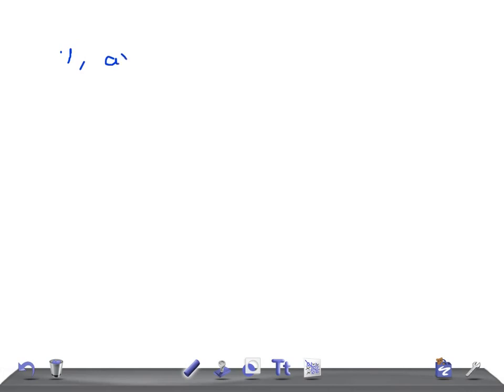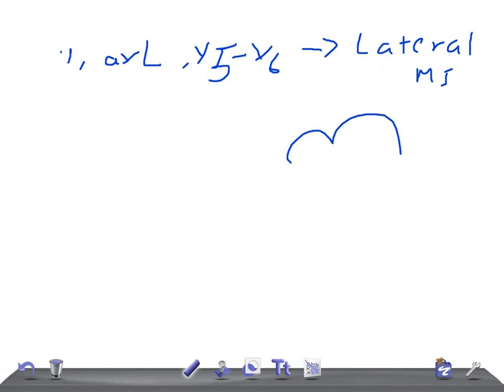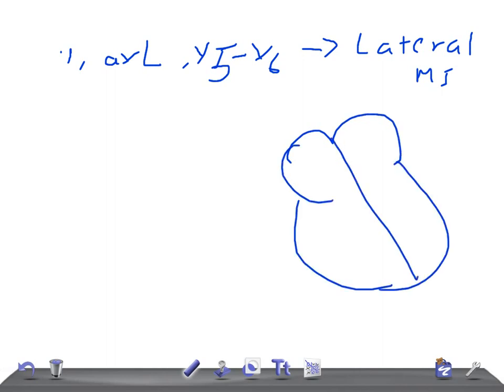If there is ST segment elevation in Lead I, AVL, and V5 to V6, where does the myocardial infarction localize? It's lateral myocardial infarction. Lateral means this wall — if this left lateral wall is affected, this is what we call a lateral myocardial infarction.